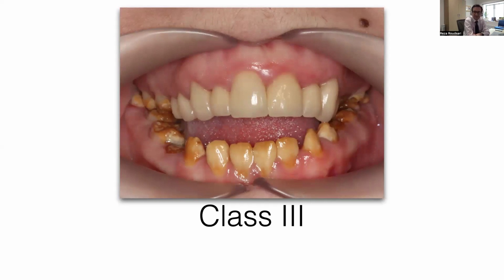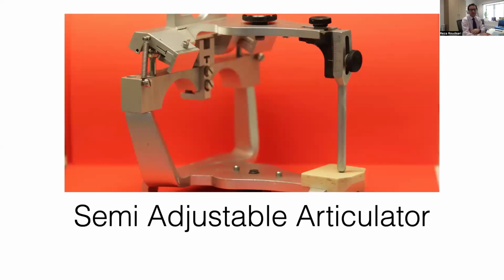So in these very, very tricky cases, obviously, as a general dental practitioner, we don't expect you to handle them. A lot of times it's really going to be to refer such complex cases to us, specialists, to help you with them. So what can you guys then use? Probably a fully adjustable articulator is a little bit over the top for somebody at the general dental practice level. So let's just come down to semi-adjustable articulators.